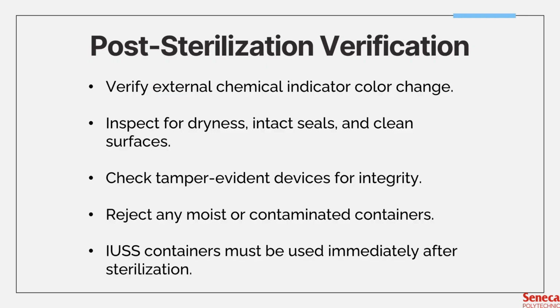They would call a technician to flash sterilize that instrument so that they can use it. It's usually done within 20 to 30 minutes. Of course, IUSS always comes with its own risks, so it's best to avoid the use of it.